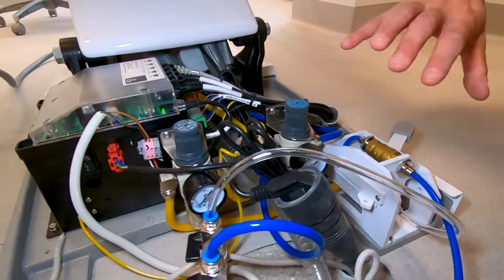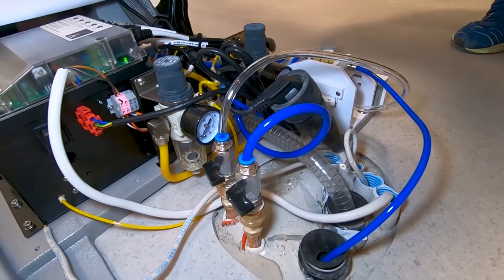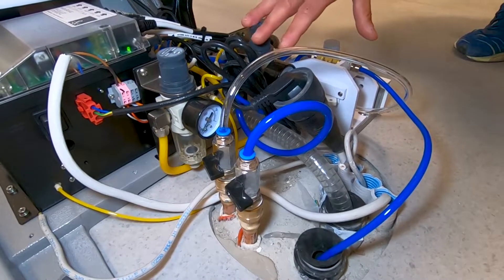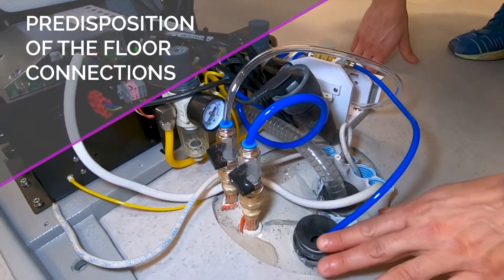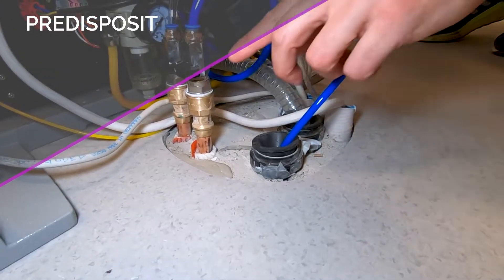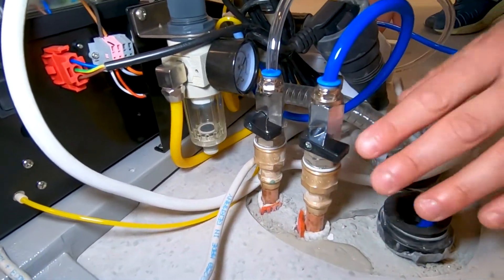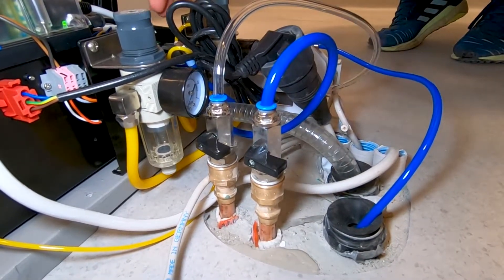This is a kind of installation that we can do when there is a selection valve and the water units and the suction is wet. As you can see, all the tubes have to be as much as possible on the floor level. These have been a bit too high, but they can work if they are very close to the center of the unit.